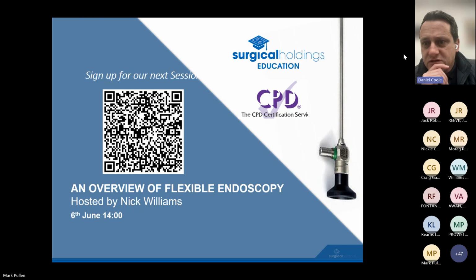Anything to add on that, Mark? No, just going back to the light lead comment. A couple of solutions that I have seen are labelling up in theatres the diameter of light leads, with a list below of scopes they should be used with. The only other option is coloured light leads. For identification, having a certain colour light lead per diameter stops any confusion. Yeah, seems a great way and an easy visual to be able to do that.